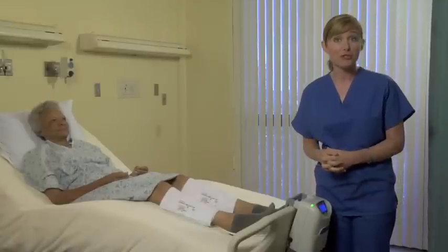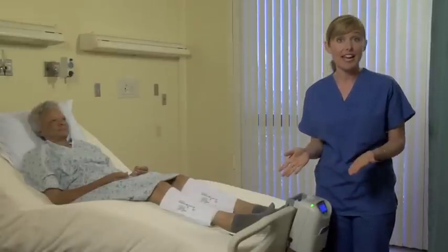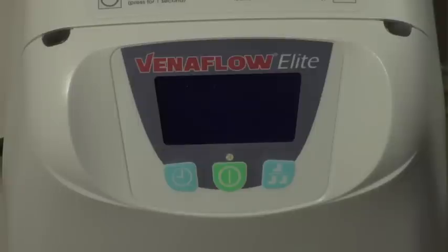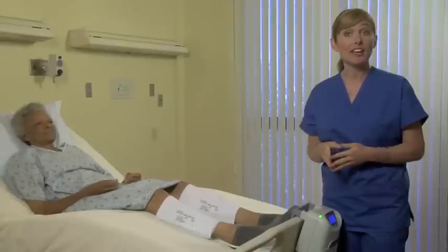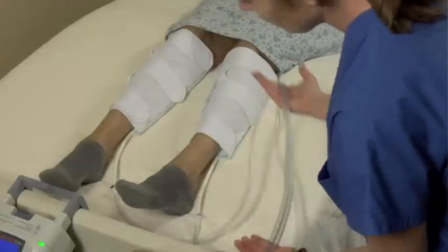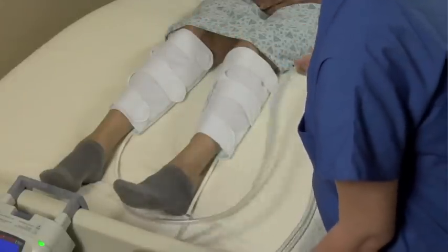Now we're ready to troubleshoot. If there is a discrepancy between what the device detects and how many cuffs are attached, the device will go into a leg alarm. If this happens, simply press the green on/off reset button and ensure the screen and the number of cuffs attached match. If there is a leak or kink in the tubing or cuffs, you may get a check tube alarm. If this occurs, press the green on/off reset button and check tubes and cuffs for obvious leaks or kinks. If there's nothing visible, then change both the tubing and cuffs.